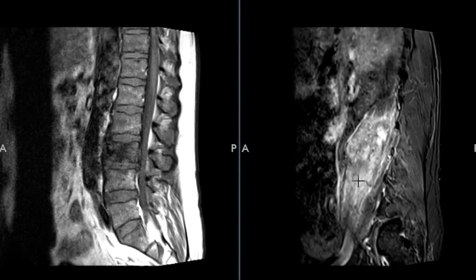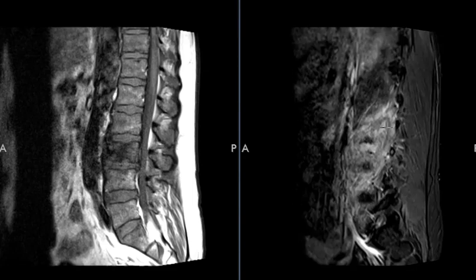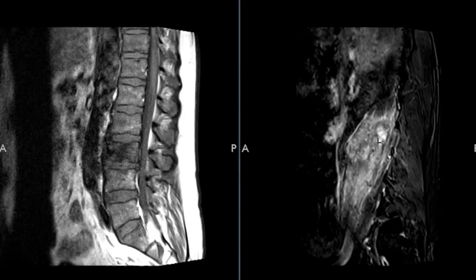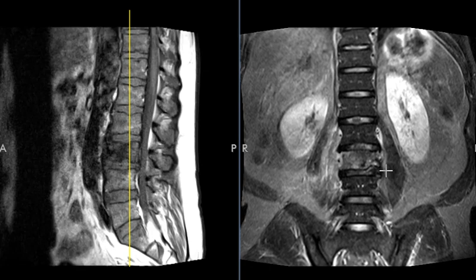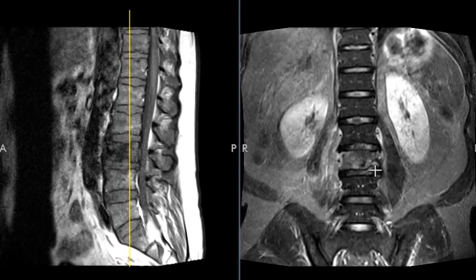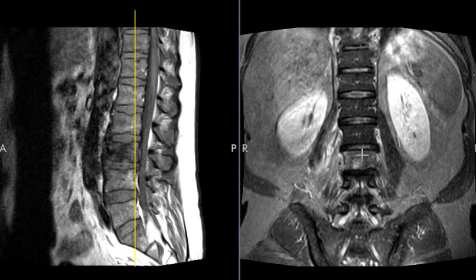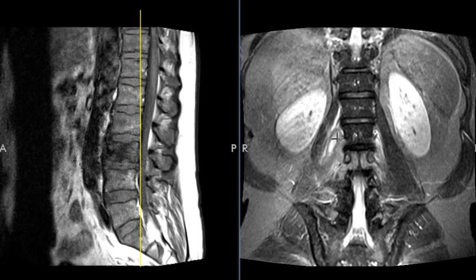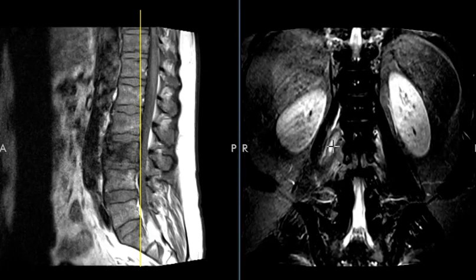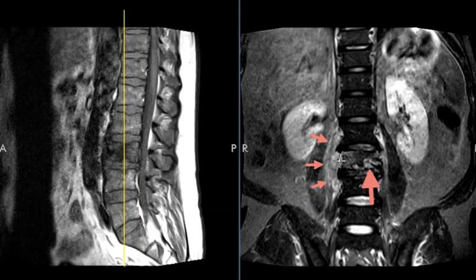Rolling to the right side, we see the right psoas muscle here. It has inflammation or edema throughout it, and there's even a little band of more localized fluid or inflammation right here. So it looks like it may be an infectious process because of the paraspinal component and involvement of the psoas muscle. But when we see a diffusely involved vertebral segment like this, we think first of cancer — is this a metastatic lesion with a developing pathologic fracture and soft tissue component? However, the paraspinal component is very circumferential, there's no bone expansion, and the margins of the bone are pretty well defined. The psoas muscle has a little tubular fluid collection — possibly a phlegmon or a developing psoas abscess on the right side.